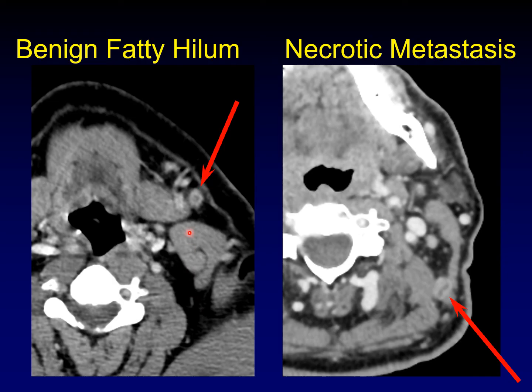So this is a classic error: to assume that a benign fatty hilum is, in fact, central necrosis. That's a benign lymph node. This one is true necrosis in a necrotic metastasis.